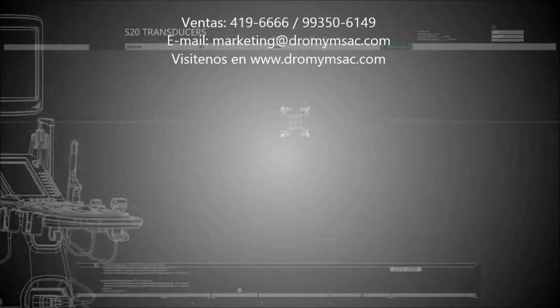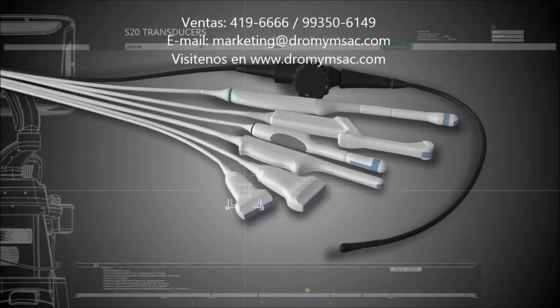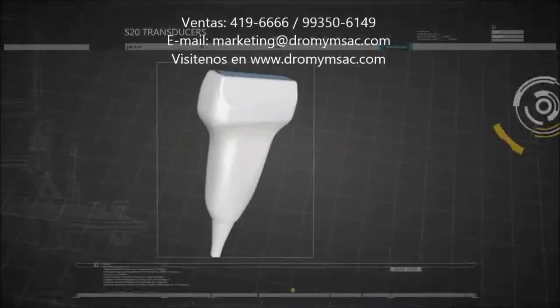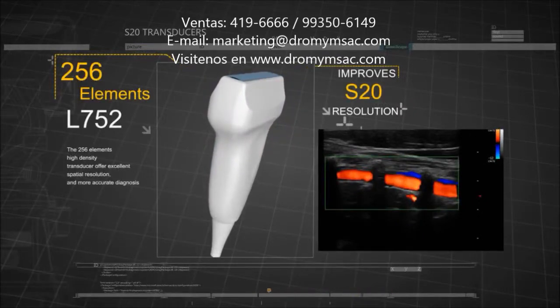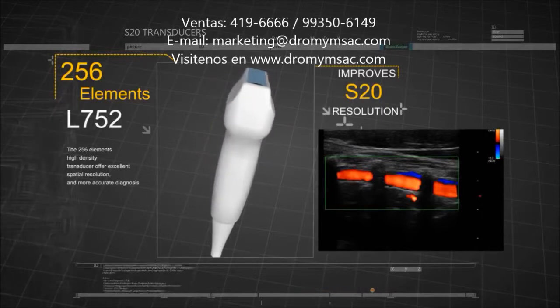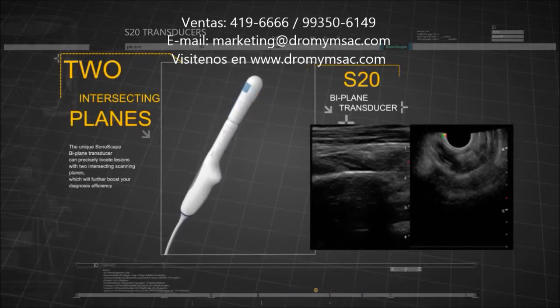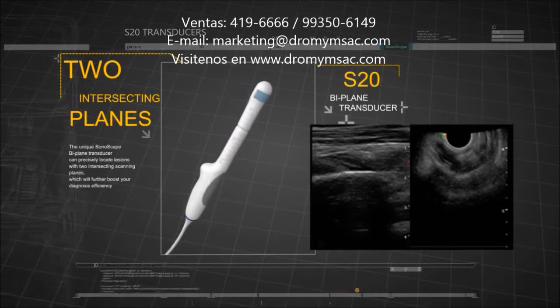S20 comes with a complete selection of high-definition transducers. This will give doctors more clinical options and better diagnostic performance. The 256-element high-density transducer offers excellent spatial resolution and more accurate diagnosis. The unique Sonoscape biplane transducer can precisely locate lesions with two intersecting scanning planes, which will further boost diagnosis efficiency.